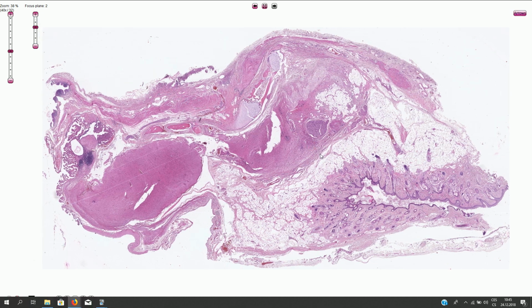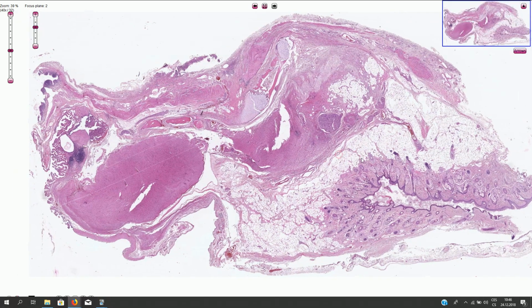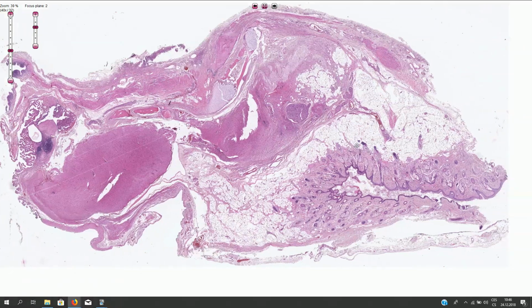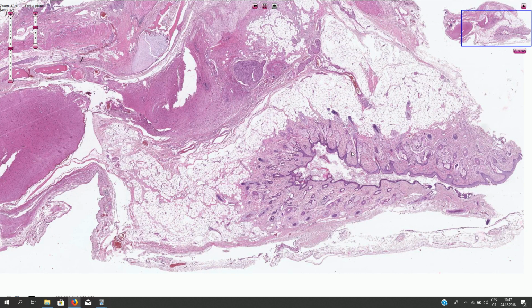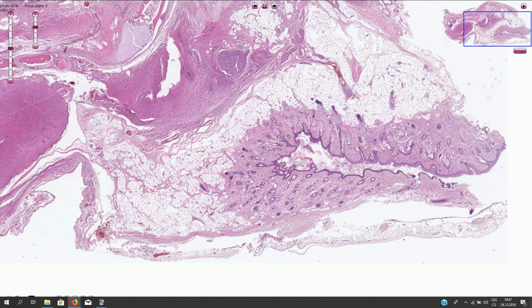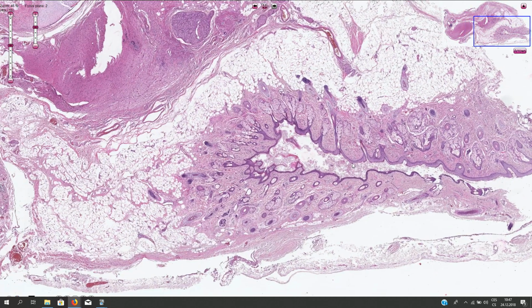Microscopically and sometimes also grossly, we can see all sorts of different tissue types. Practically anything can happen in this tumor, and it is kind of good histological exercise. So let's have a look if we can recognize what we see here. Skin is very commonly present in the mature teratoma. Sometimes we can find only skin with skin appendages. In that case, this tumor can be called a dermoid cyst. It is usually a cystic tumor filled with keratinaceous debris.